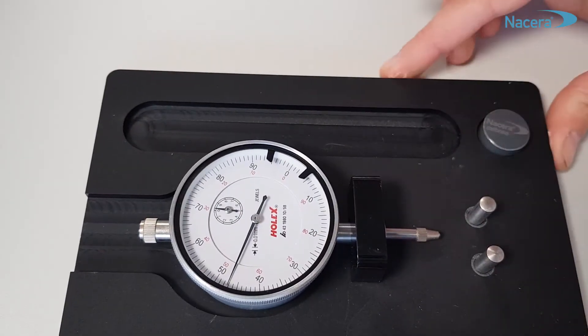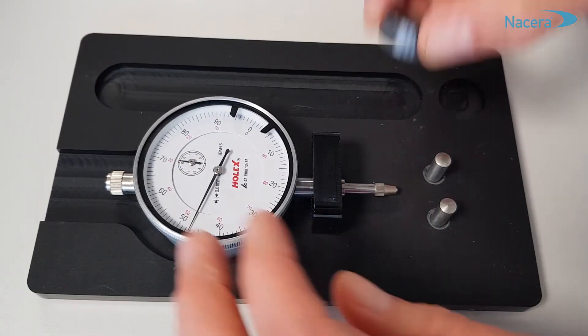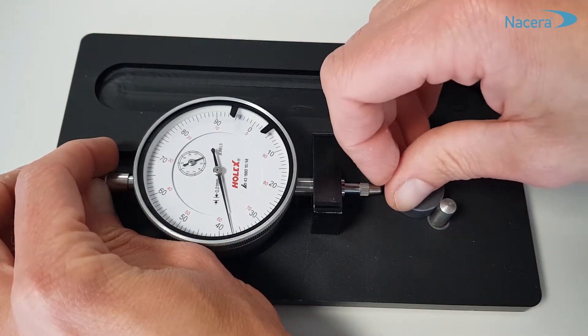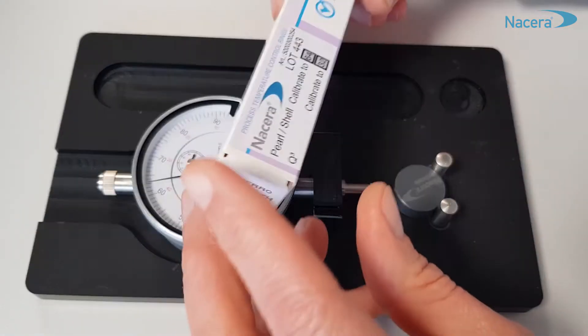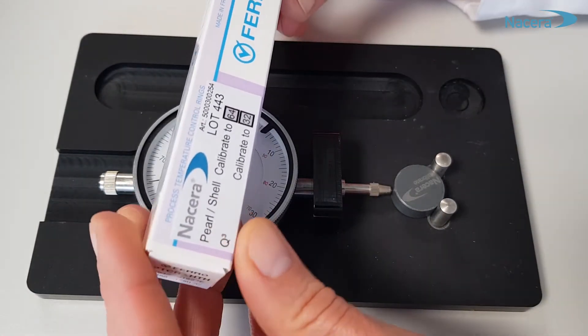After the sintering process is completed, remove the ceramic ring from the tray and get the measuring gauge from the set. Insert first the gray calibration body into the device. Tap slightly the base plate to align the calibration gauge. Set the gauge dial to the material-specific value given on the ceramic ring's packaging.